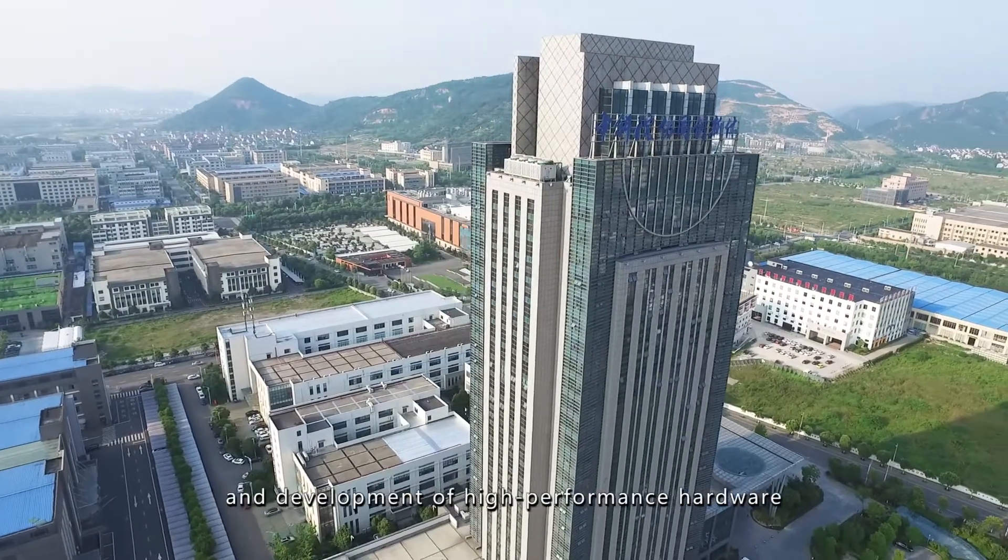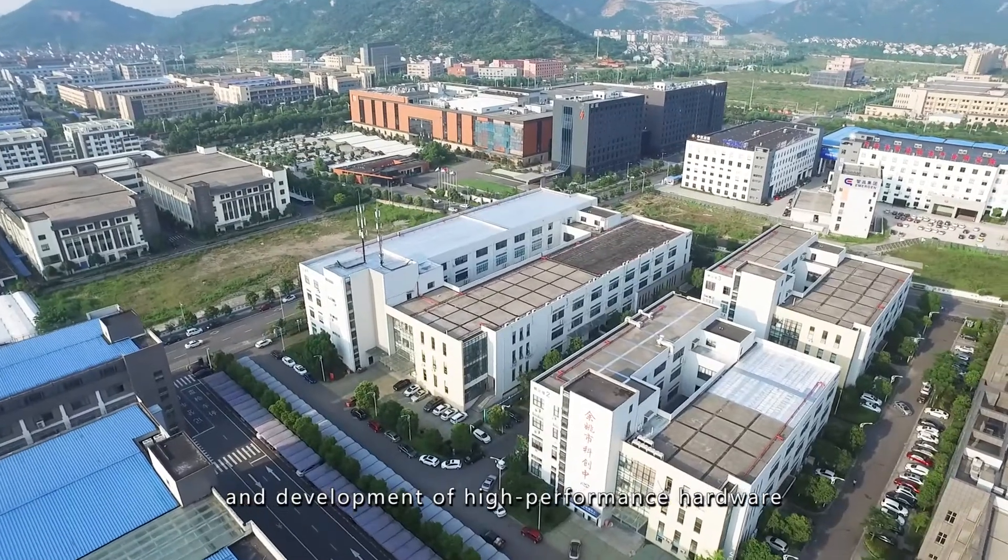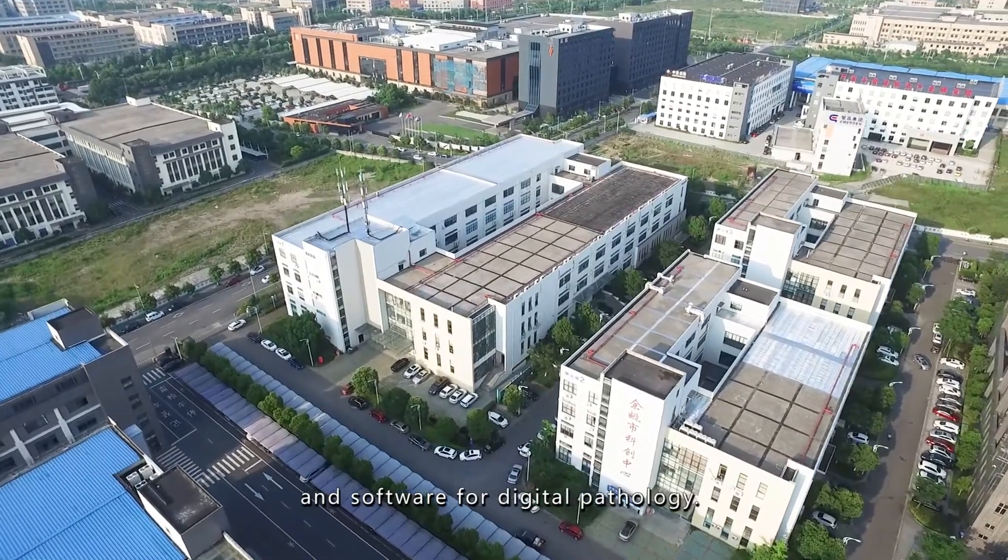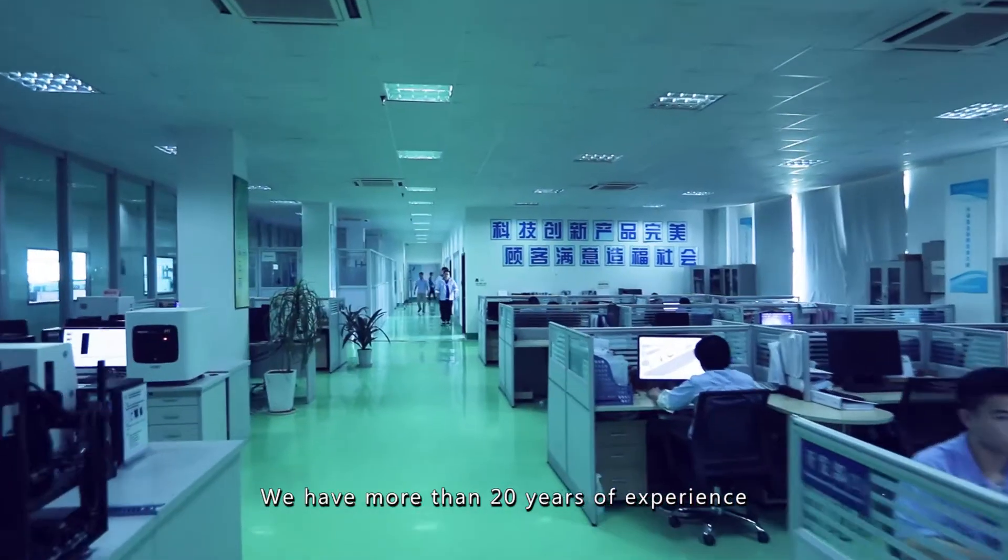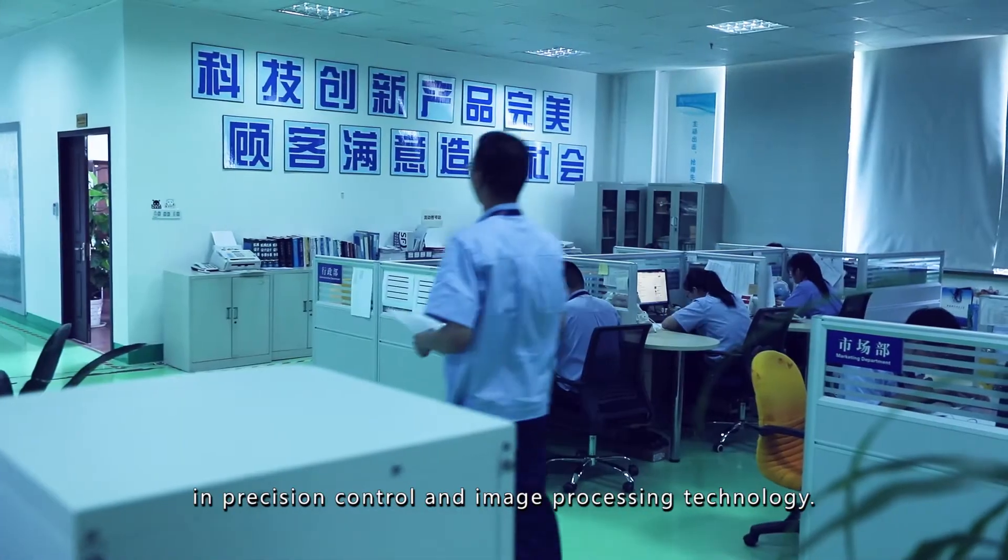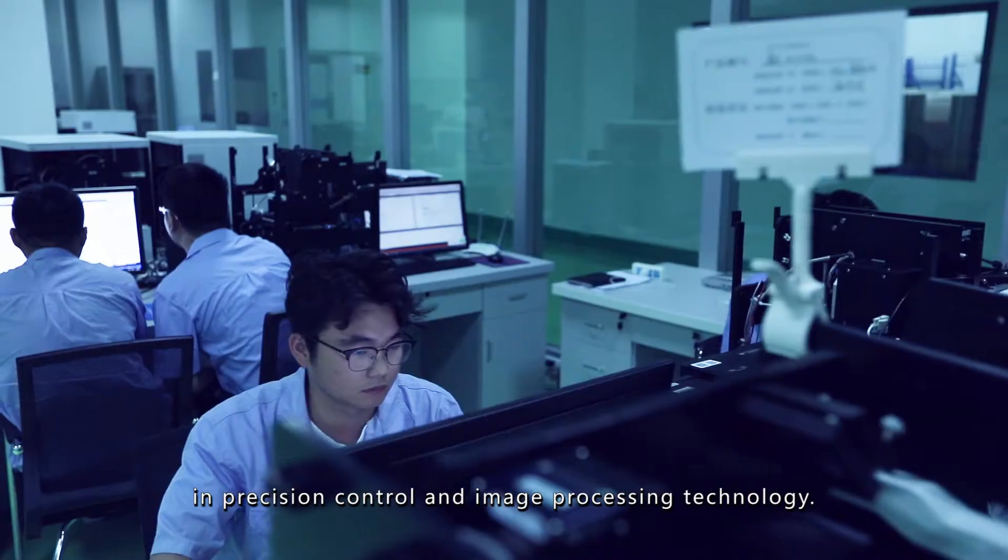Our team has been committed to research and development of high-performance hardware and software for digital pathology. We have more than 20 years of experience in precision control and image processing technology.